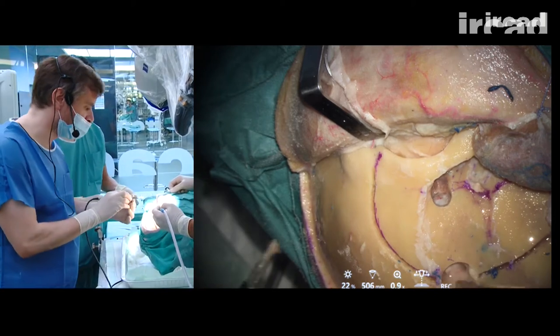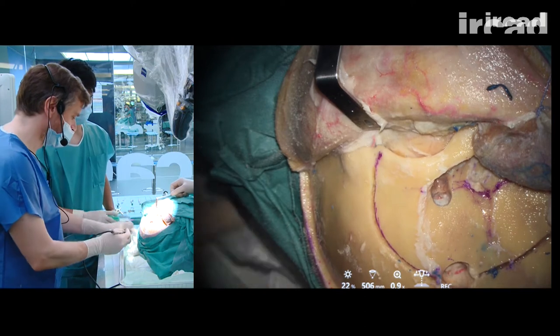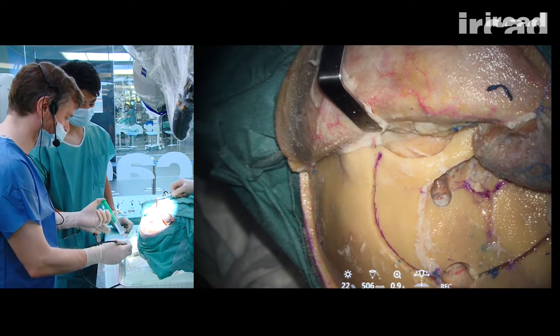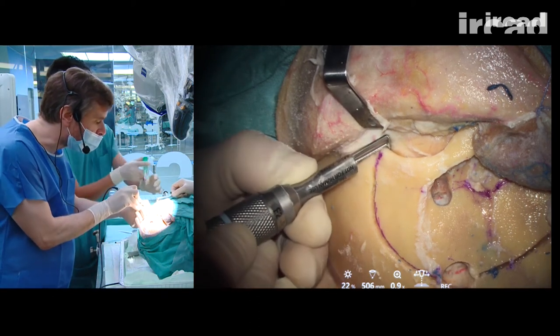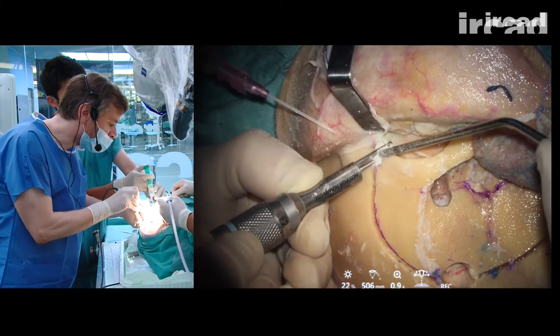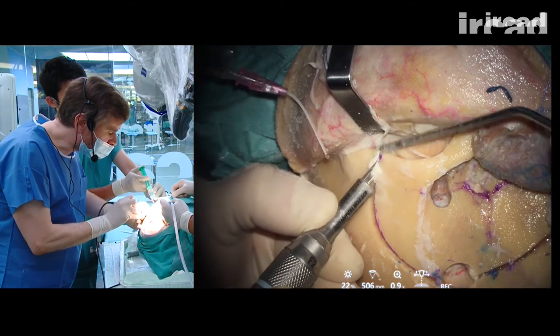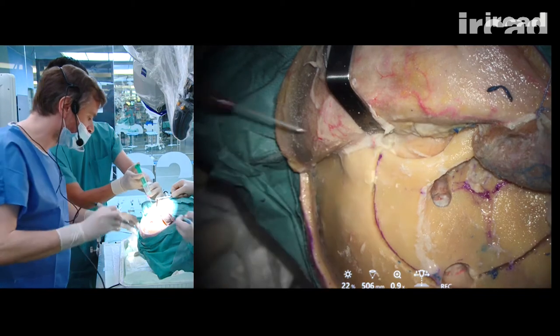Arroser pour bien nettoyer la sciure d'os. Arroser. C'est bon. I go reverse. Okay.